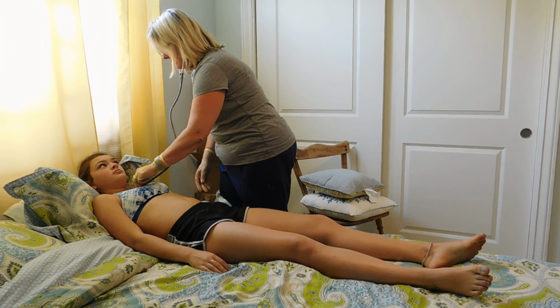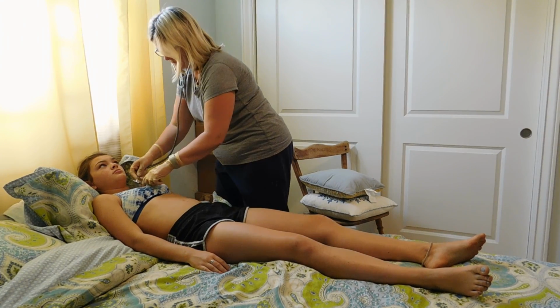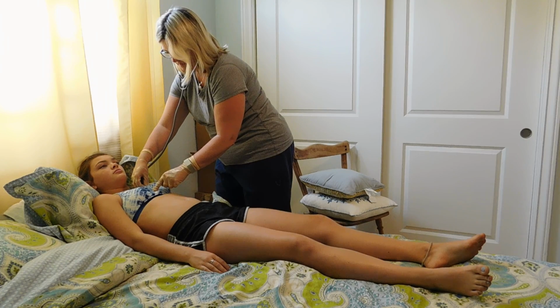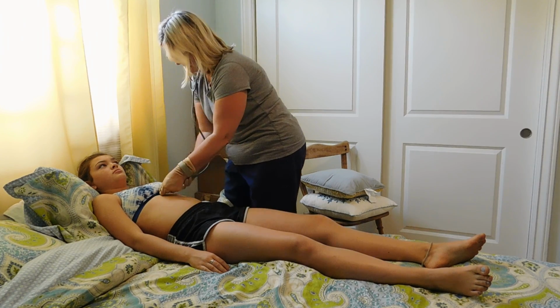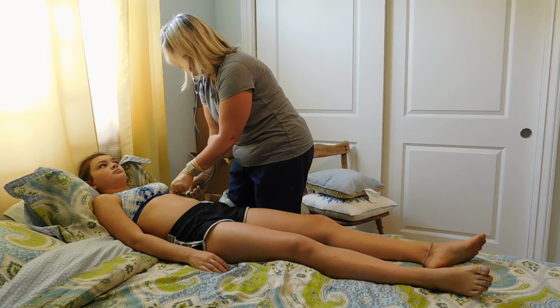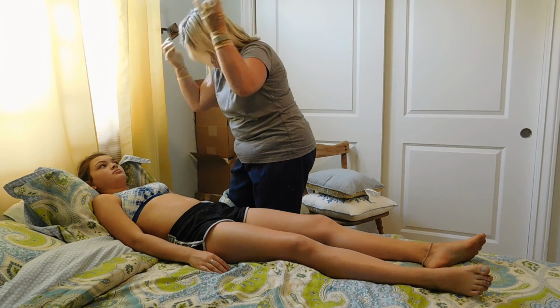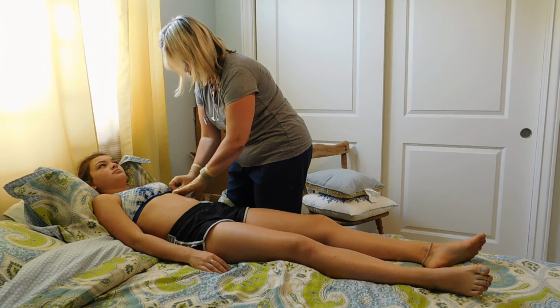Aortic. Pulmonic. Erb's point. Mitral. Tricuspid. And I'm now checking for apical.